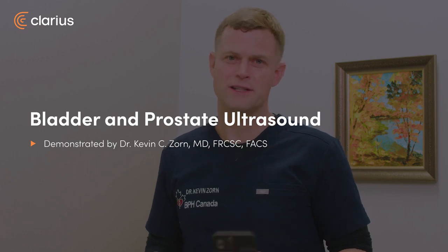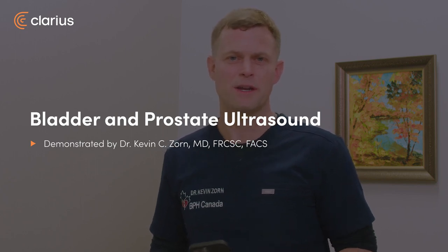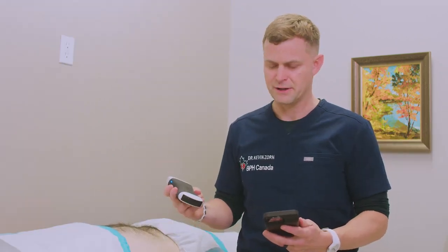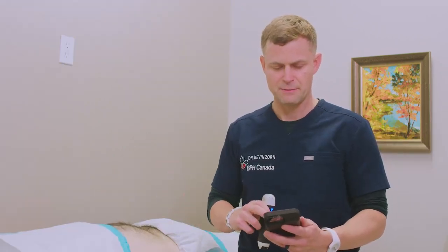Hi, I'm Dr. Kevin Zorn and today I'll be performing a Clarius ultrasound for my patient looking at his bladder and his prostate to evaluate his lower urinary tract symptoms. I have the C3, the small curved array third generation Clarius system, and I'll be linking up now to my Clarius app on my iPhone to have the pre-programmed prostate settings so it will best discriminate the tissues around the bladder and the prostate. So let's begin.